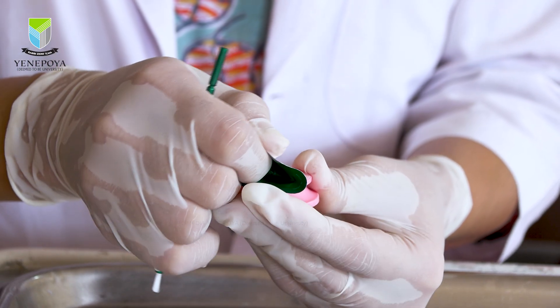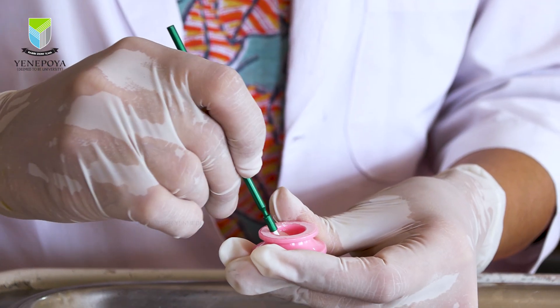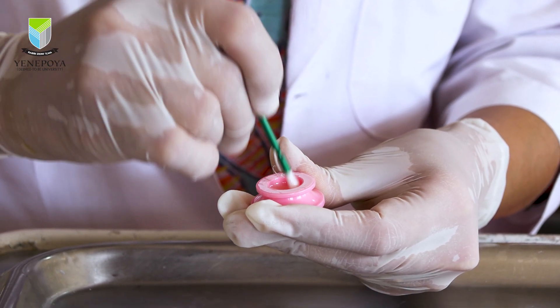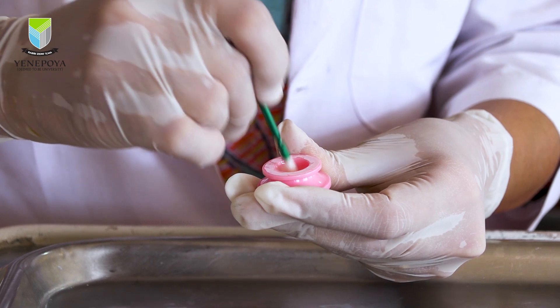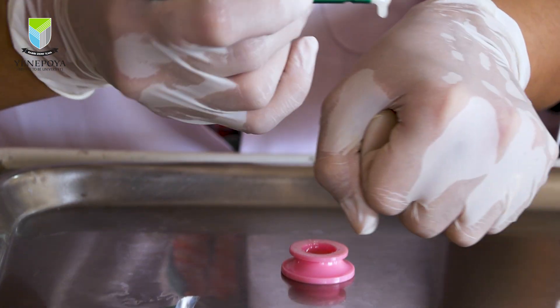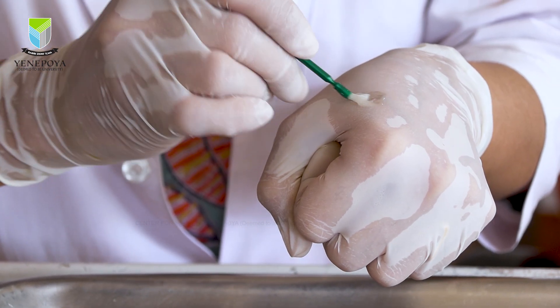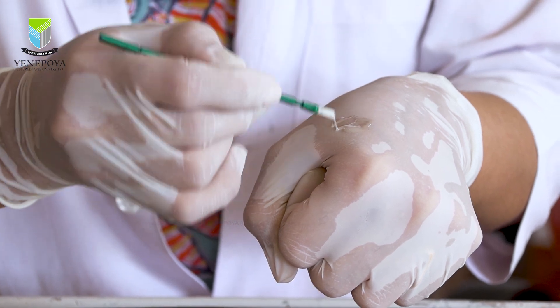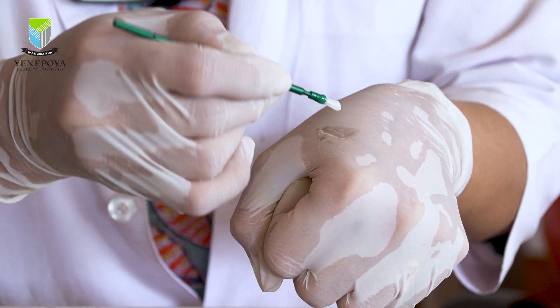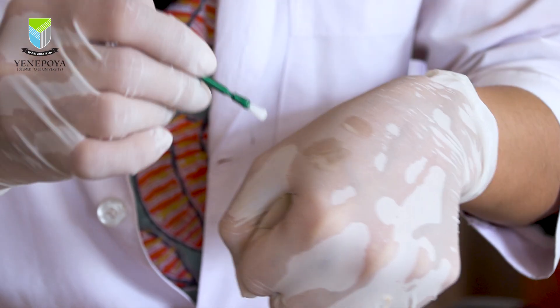For this video I have chosen MI varnish. On opening the seal you need to mix it well, because a lot of times it separates and you need to make sure that you have a good and even mixture. Make sure to remove any excess varnish from your brush because you just want a thin layer over the tooth. Too much of it can make it sticky and the patient will tend to try and remove it with the tongue before it sets.